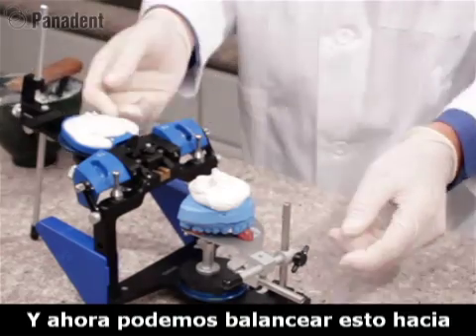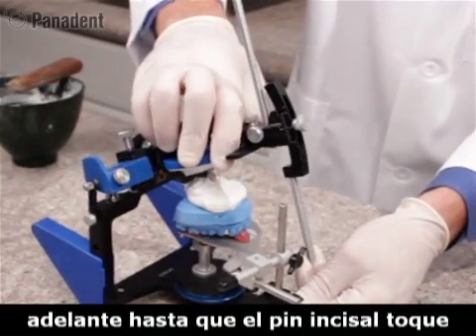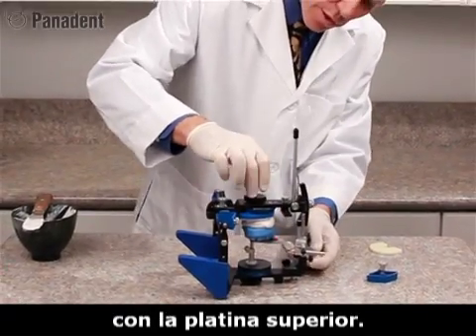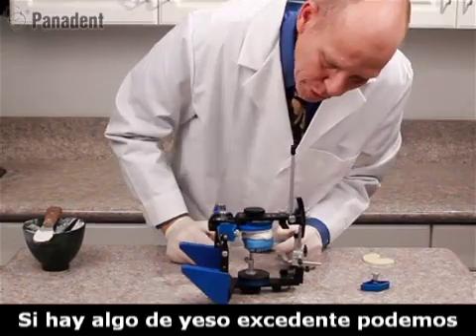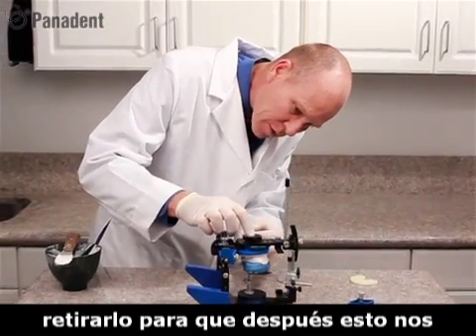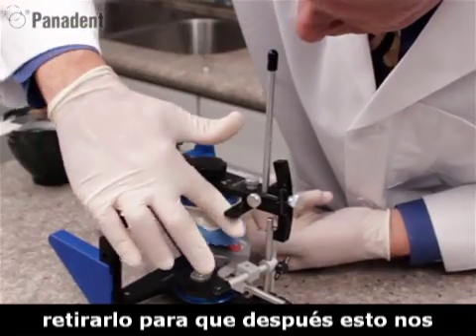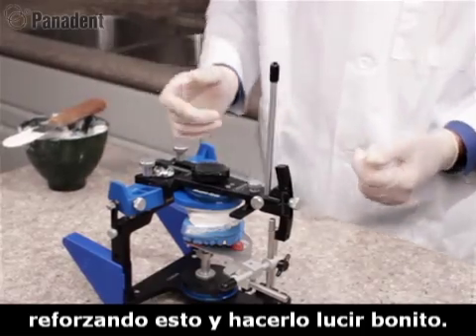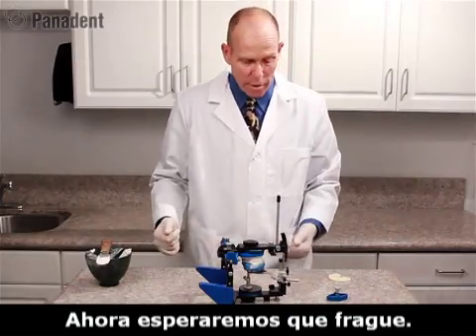We swing the articulator around until the incisal pin touches the mounting fixture, making a connection of the cast to the mounting plate. If any plaster has extended beyond the mounting plate, we wipe that away now. This gives us room to add more plaster later to beef it up and make it look clean. We'll let this set at this time.